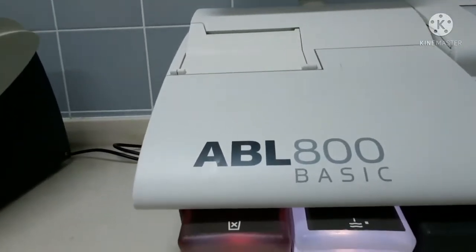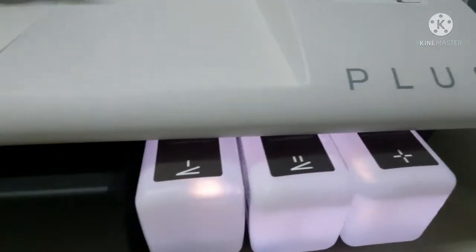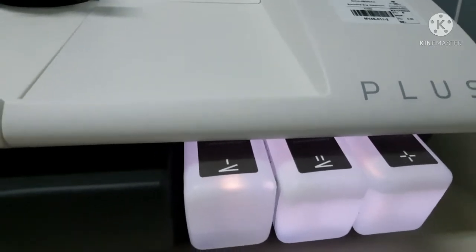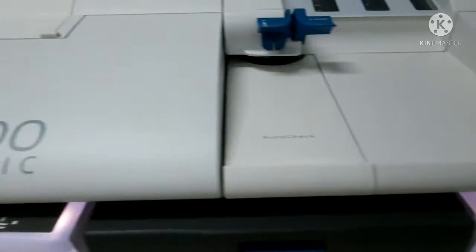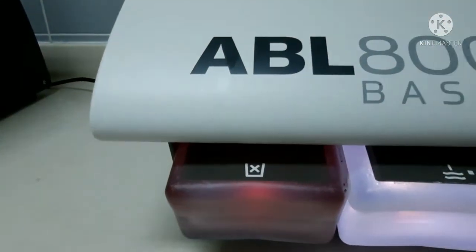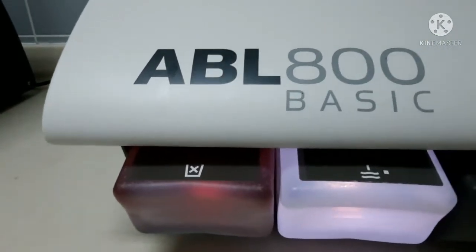This blood gas analyzer has different solutions. The Biomed is the one responsible to replace it if already empty. This is the waste receptacle. We can change this if already full.